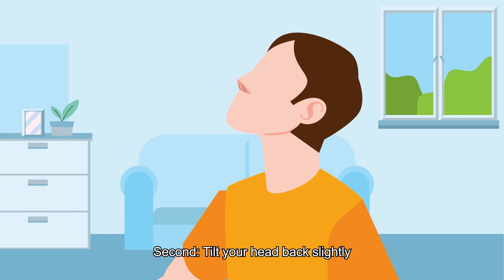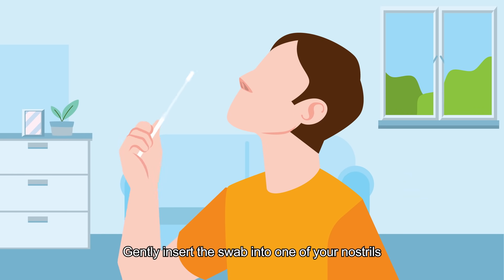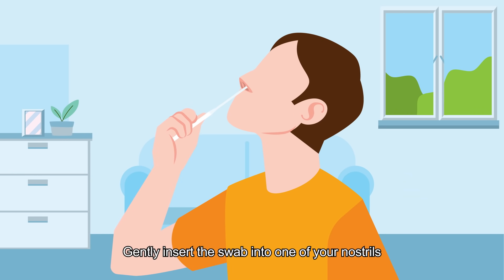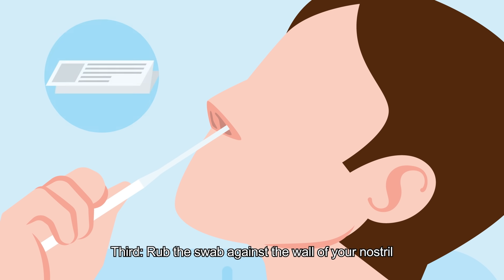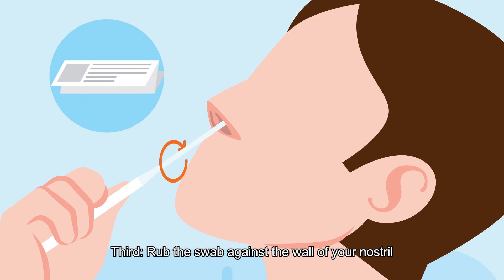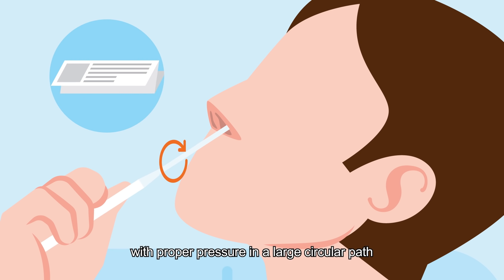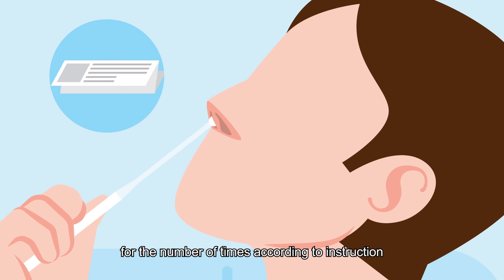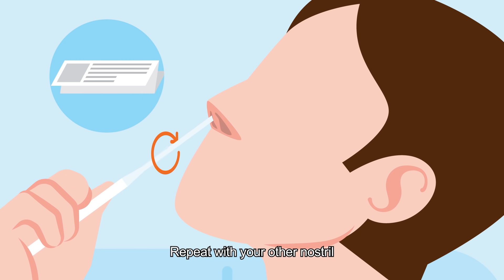Second, tilt your head back slightly. Gently insert the swab into one of your nostrils. Third, rub the swab against the wall of your nostril with proper pressure in a large circular path for the number of times according to instruction. Repeat with your other nostril.